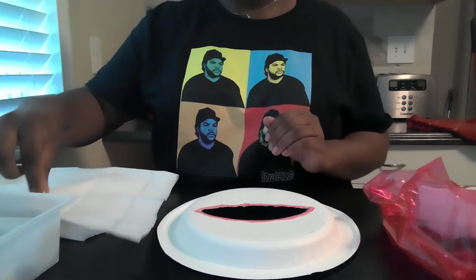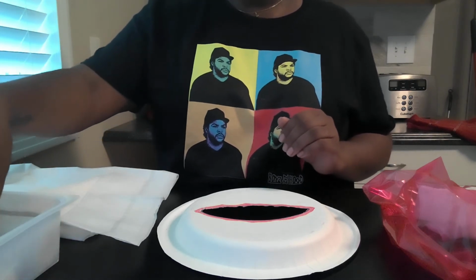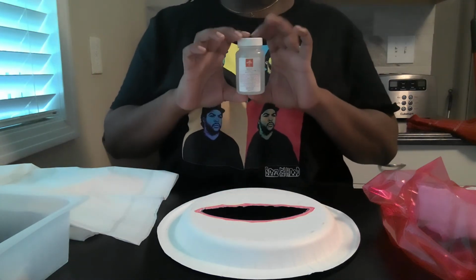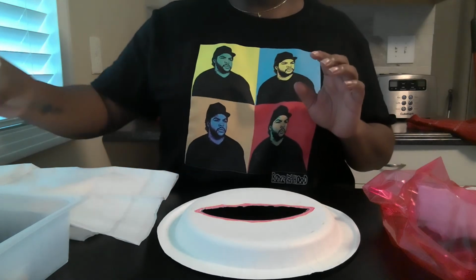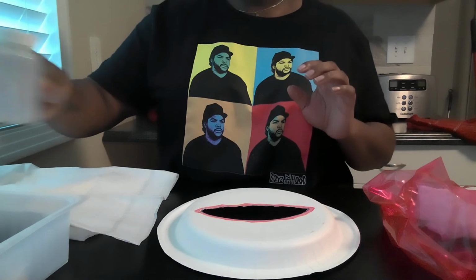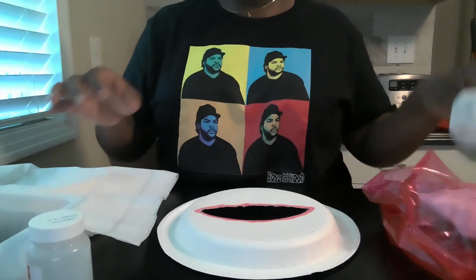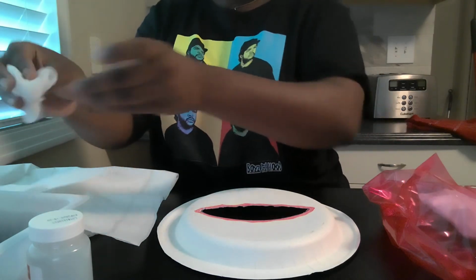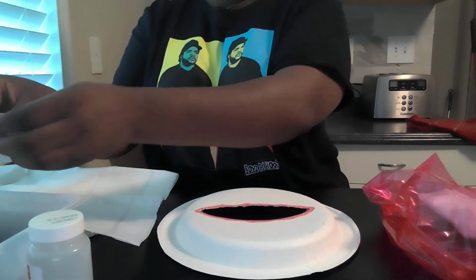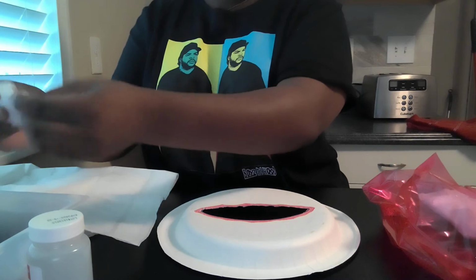And on that sterile field, I can place my items, my new gauze, my tape, and just have those things close to me. And also in your packaging, you will have some saline. You want to pour that saline into the packaging, because it has a container for it, and we're just going to do that wet to dry dressing. We're going to put the gauze in the saline and drain it a little bit so it's a little damp, because you don't want it to be dripping, but just damp.